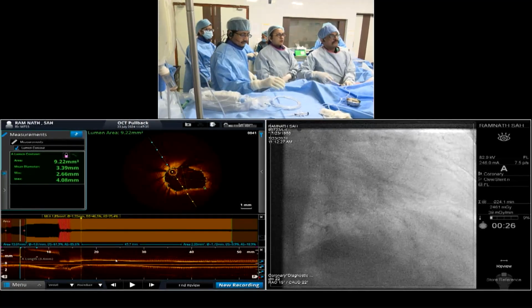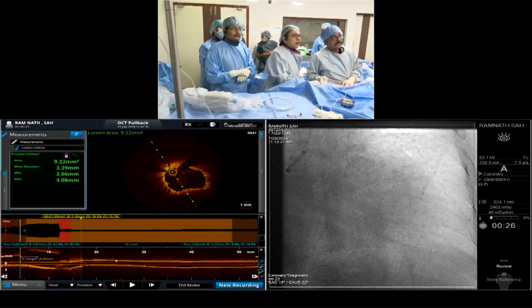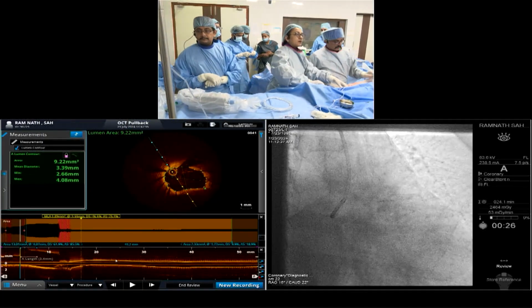One final thing without the wire. Yes, sir. Okay, let's take a final shot without the wire.